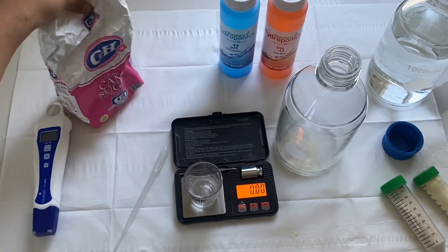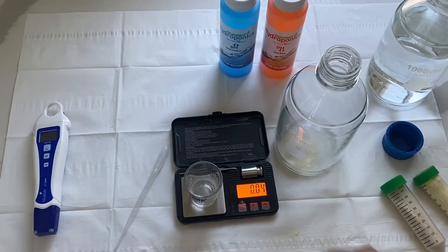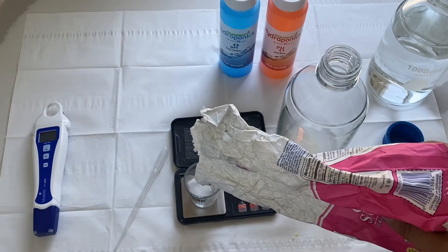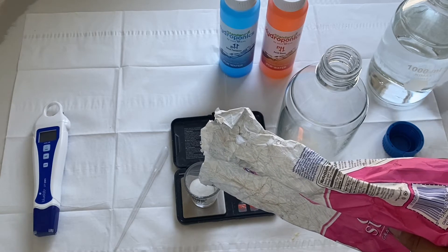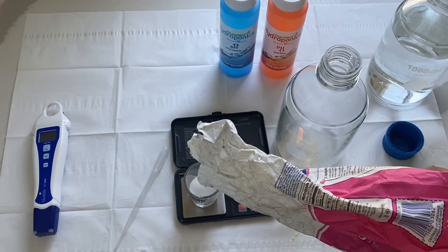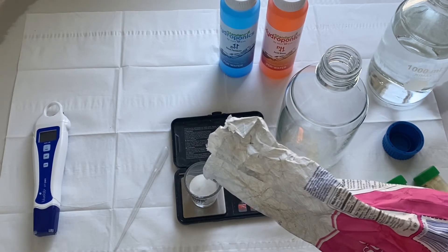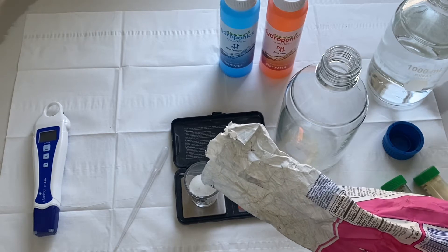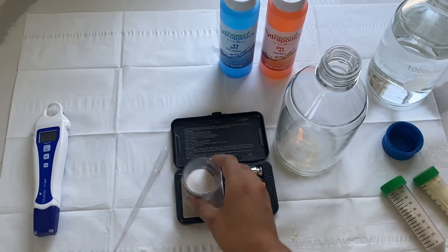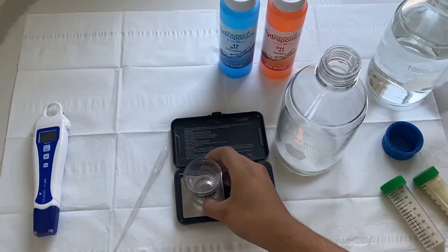Then we're going to do 15 grams of sugar — it would be 30 grams for a full liter. If you want to increase your rooting, you can decrease your sugar to 2% instead — 2% is much more ideal for rooting. So that's our main ingredients as far as powders.